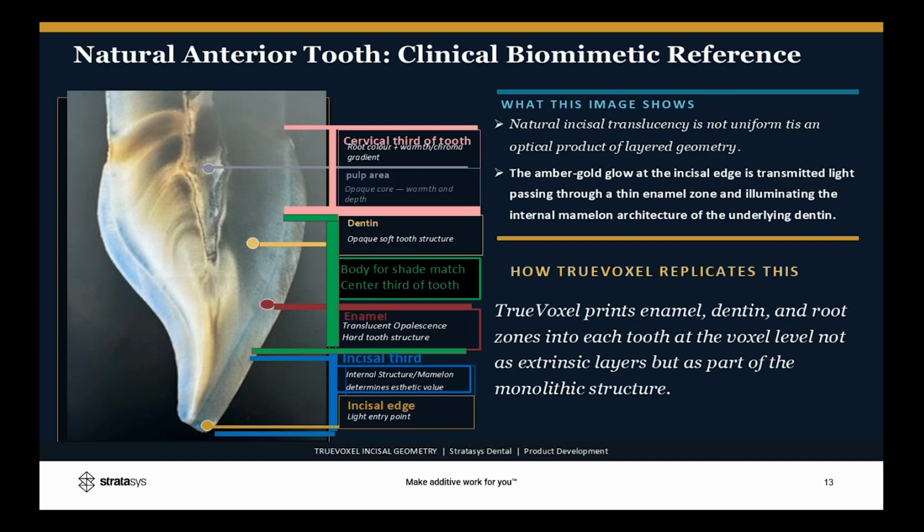He was an integral part in the development of especially this amazing user interface that he created, along with the GrabCAD team who utilized machine learning, and our R&D team, through many iterations. It's a revolutionary product that we're presenting to you today.